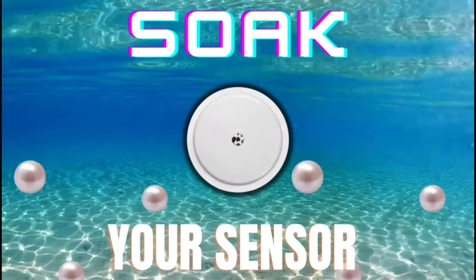So how is this bad? Well, for those of you who like to soak your sensor — meaning applying a new sensor before the old one expires to improve accuracy during those first 24 unreliable hours — because of these magnets, the days of soaking your sensor are over. But my hope is that with the new improved accuracy of the G7, soaking your sensor may no longer be necessary.